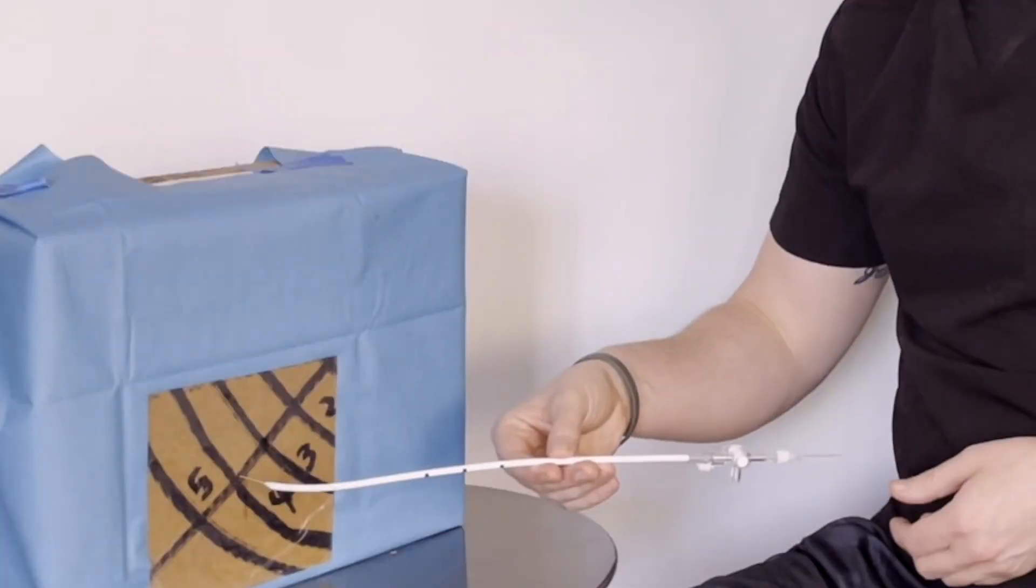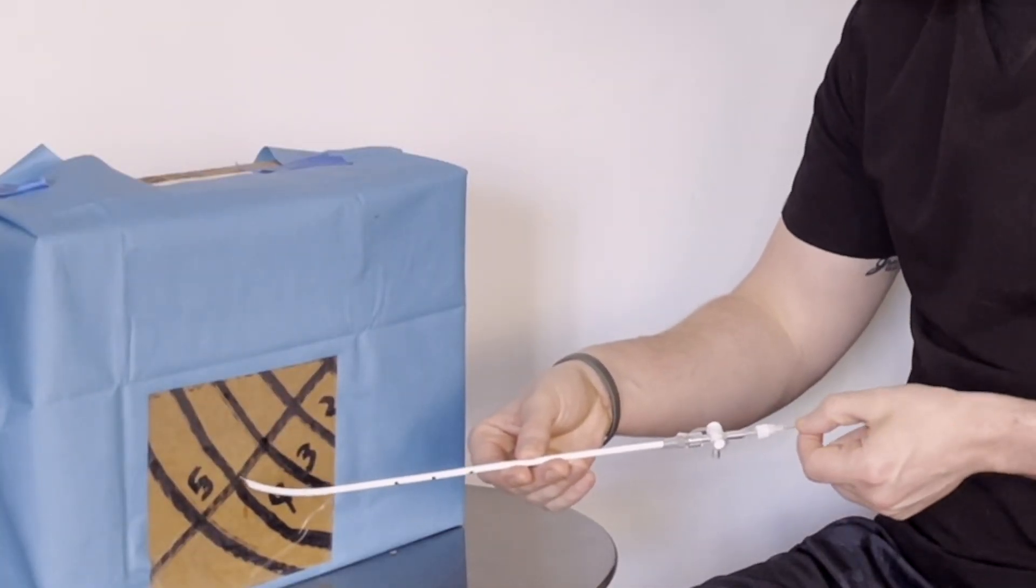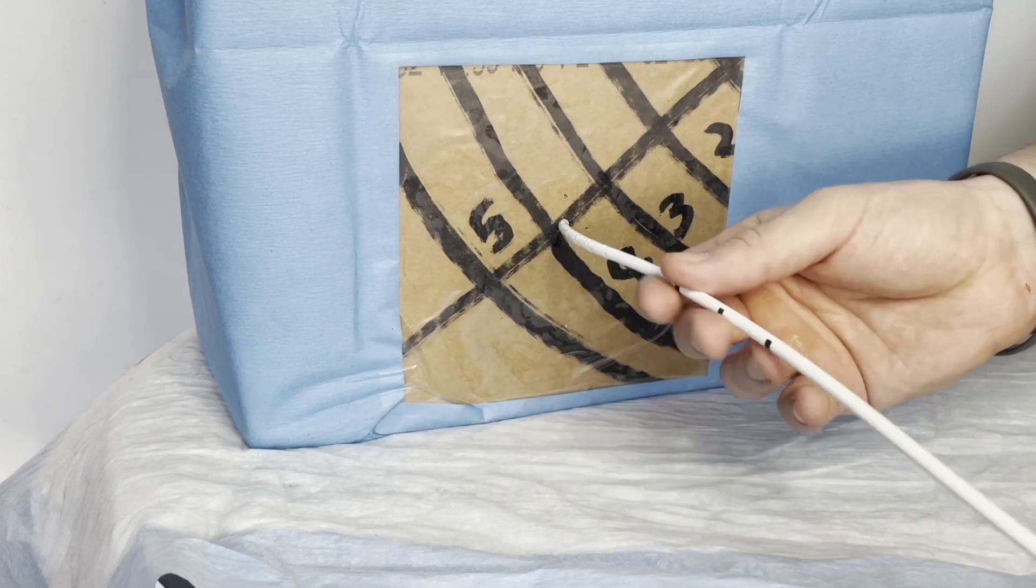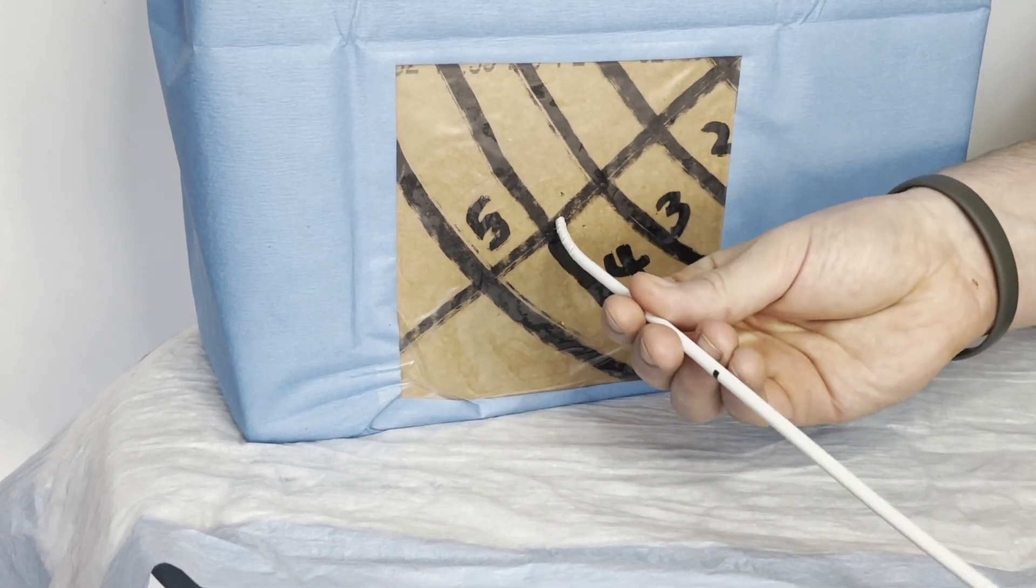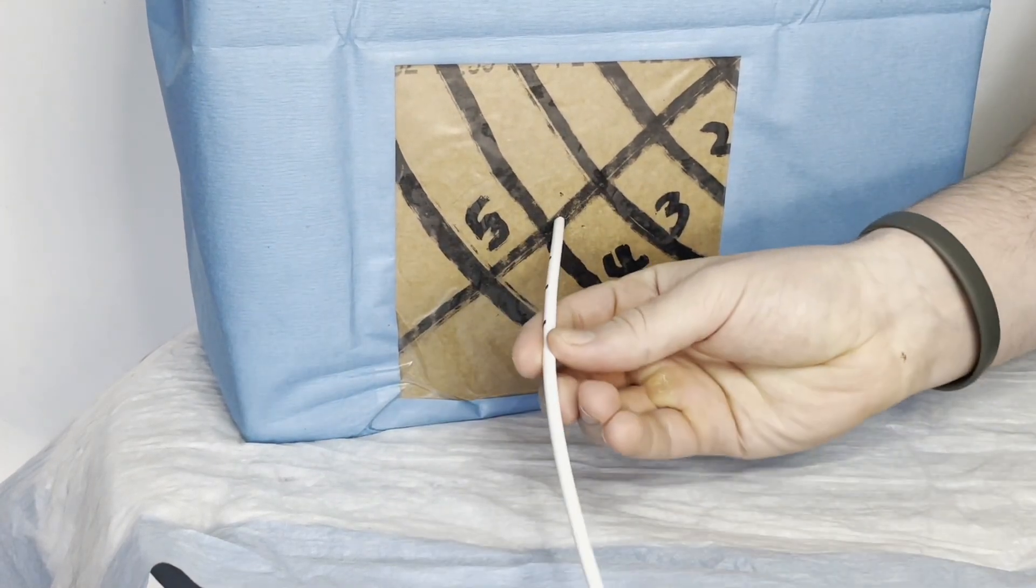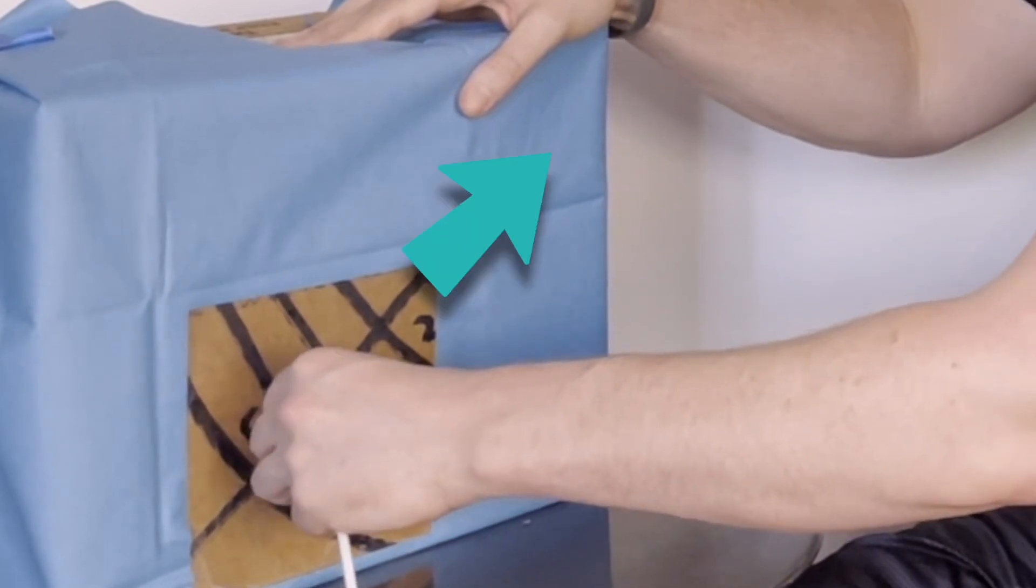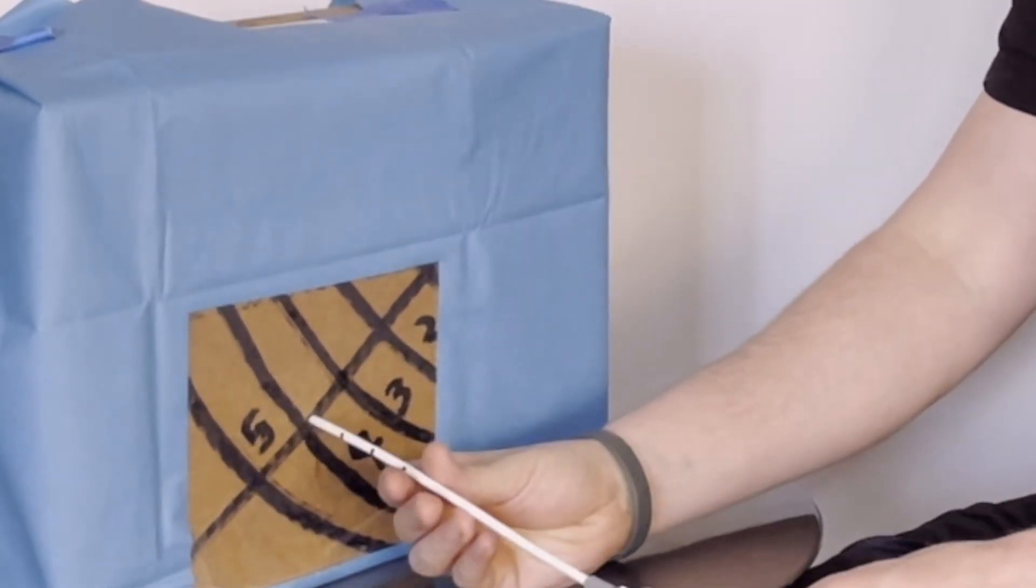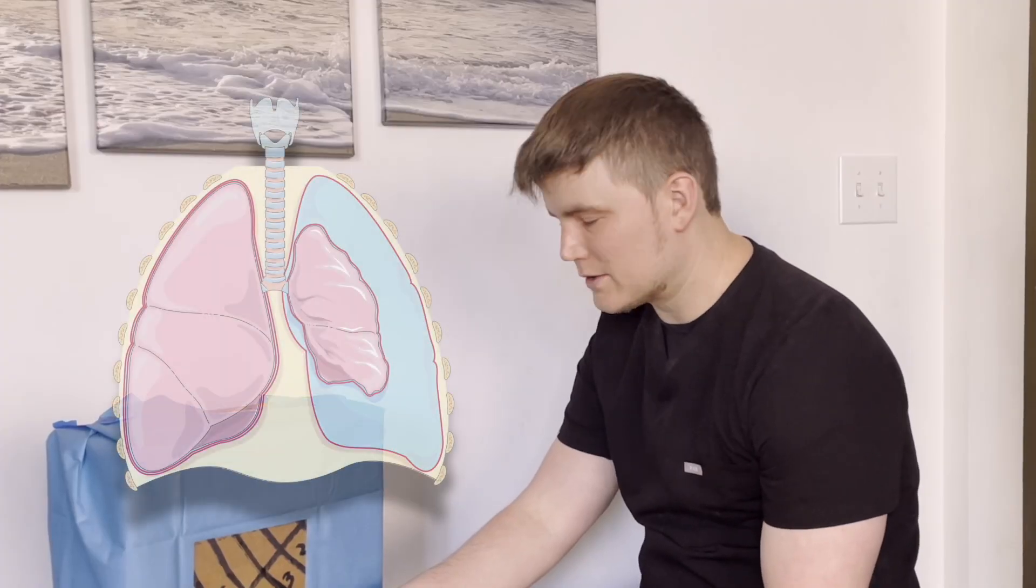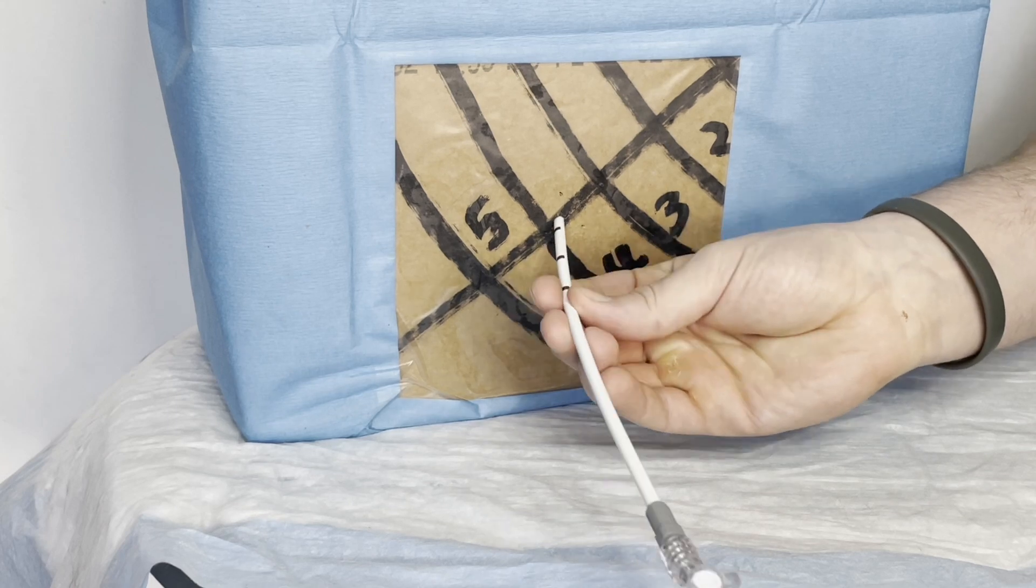Alright, so now we've pulled out the guide wire and it comes out this end here. We're going to grab a hold of that, give us a little bit of slack, and then we are going to insert our pigtail cap. And we're going to hold on to the guide wire here so we don't lose it inside the chest cavity. We're going to direct our pigtail anteriorly as we have a spontaneous pneumothorax. We're not doing this for a hemothorax or an empyema. So we've directed towards the head.